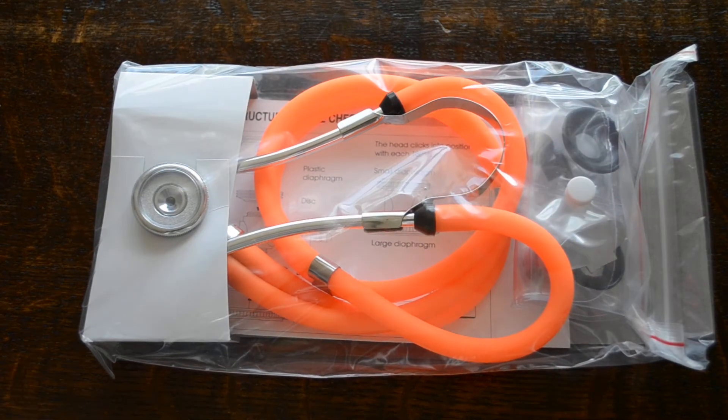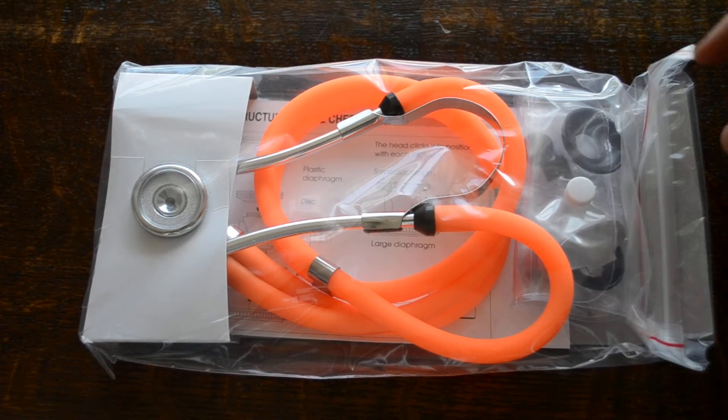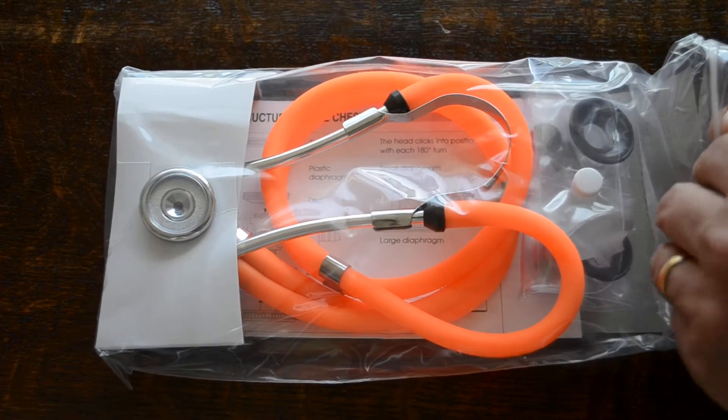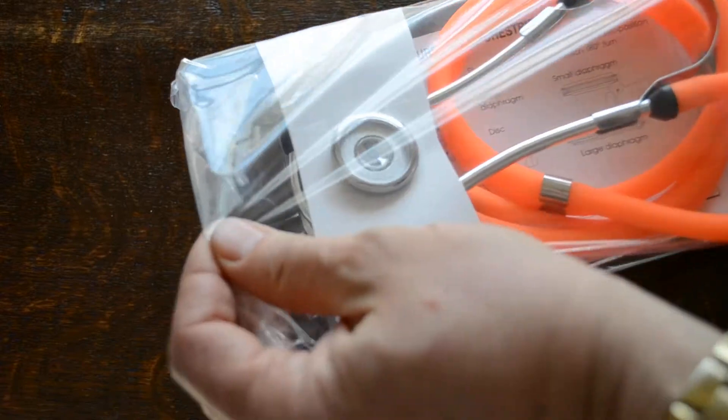Anybody wanting something that's going to stand out from the crowd, here you've got this really day-glow, almost translucent orange tubing on this Sprague which really is going to make it difficult for anybody to take from you without being noticed.